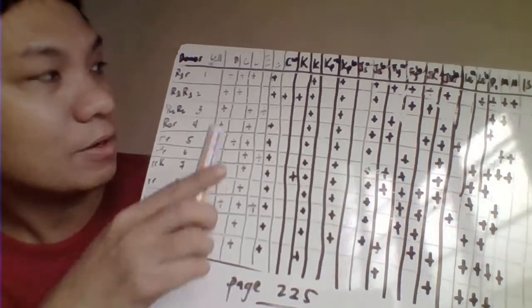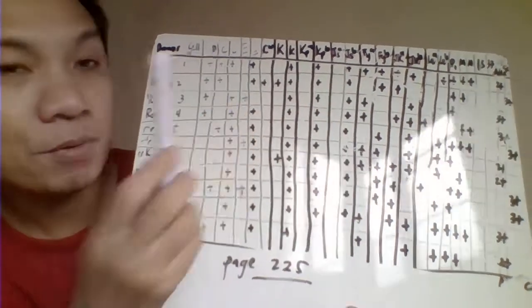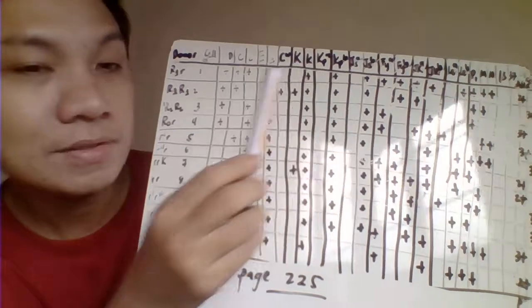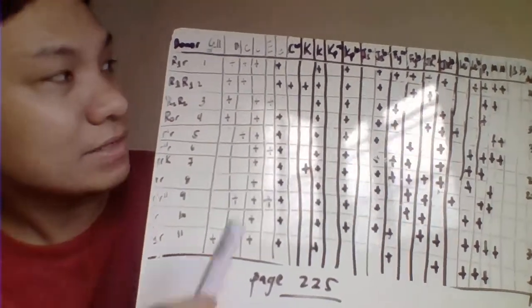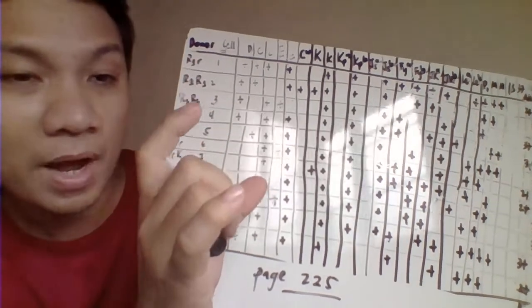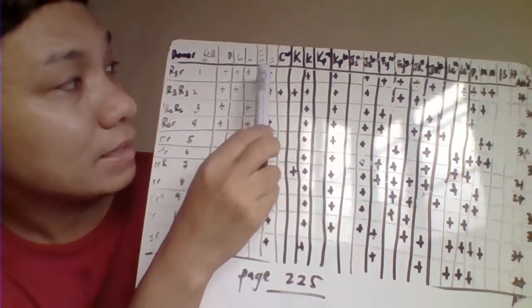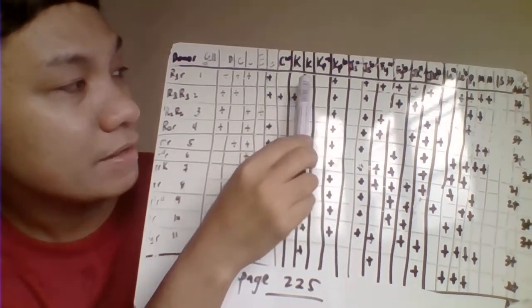Your panel cell here, this is one panel cell. For example, in your panel cell number 1, all the positives mean that is its content of antigens. For example, your panel cell number 1, or vial 1, is positive for the D antigen, the C antigen, small c, big E is negative, it has no big E, small e is positive.